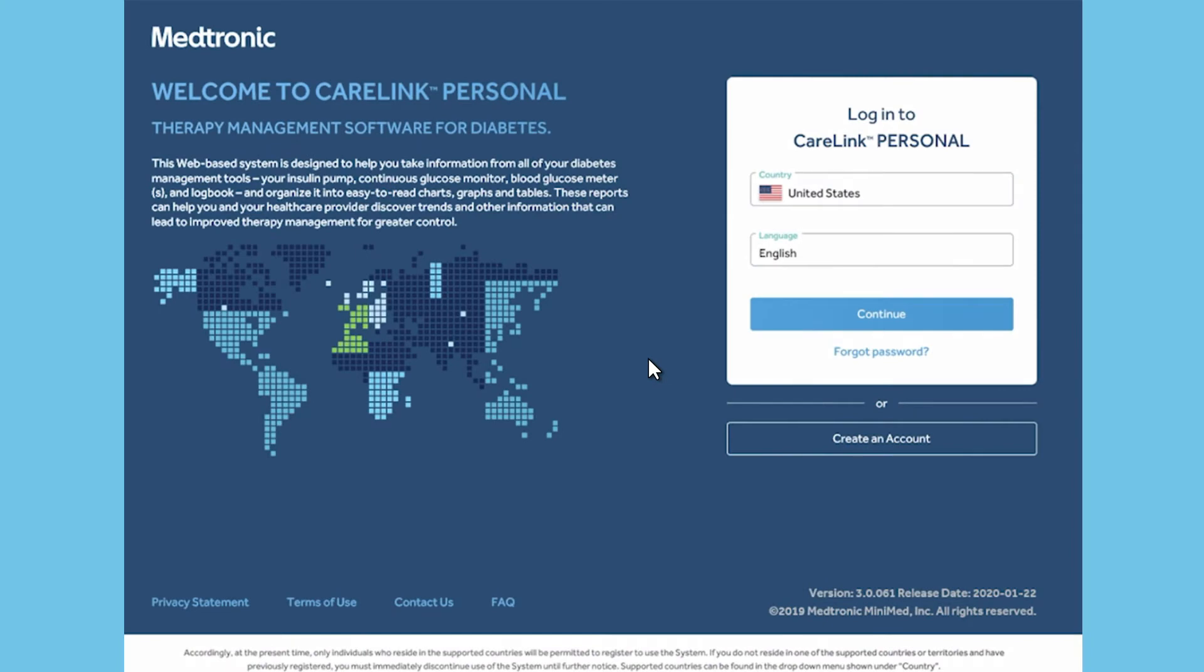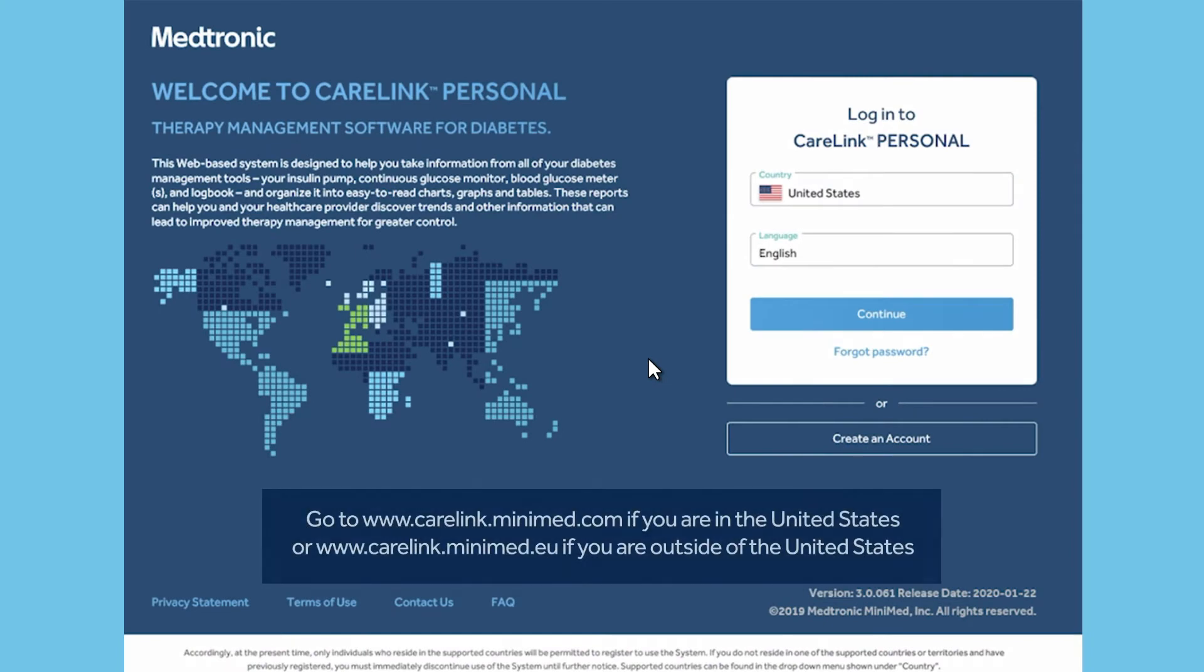To create a CareLink account, go to the Medtronic Diabetes CareLink Personal website and select Create an Account.